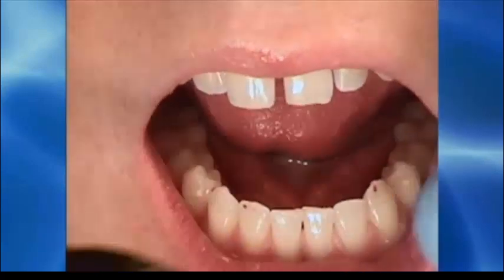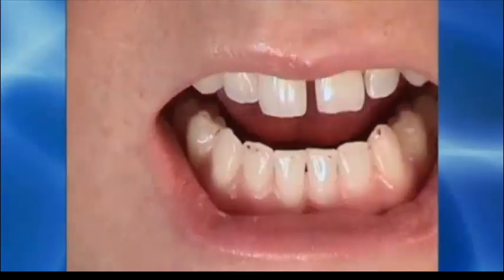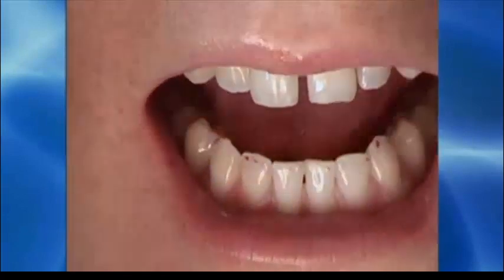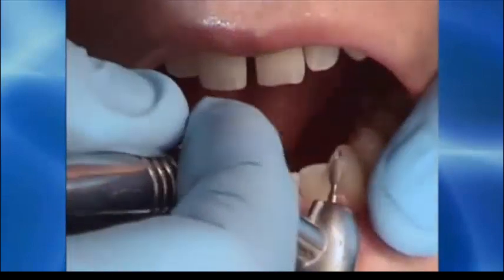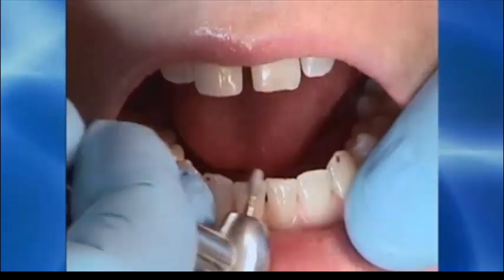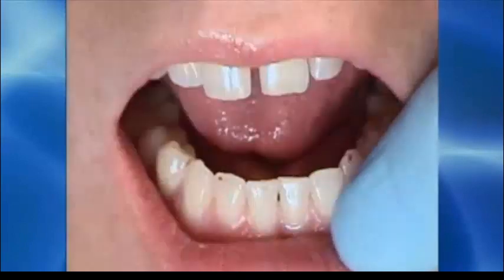So we will remark the teeth in the patient's habitual closure in order to assess the remaining amount of surface engagement after one adjustment. You can see there's definitively less surface engagement, and I'll refine it some, looking for small contact points and lace-like marks that will be near the contacts that are desirable. You see I'm planing the edges back at an angle.